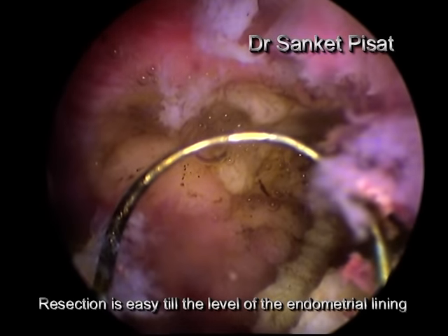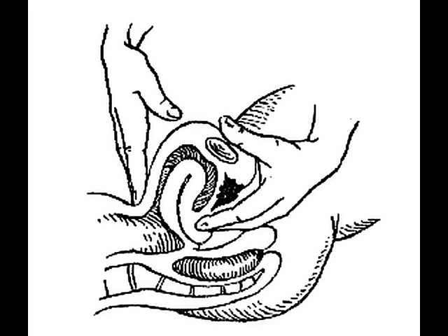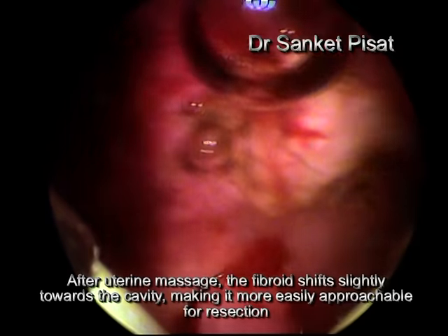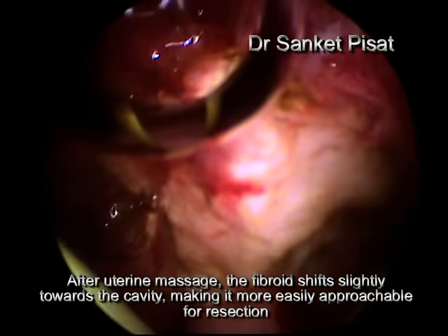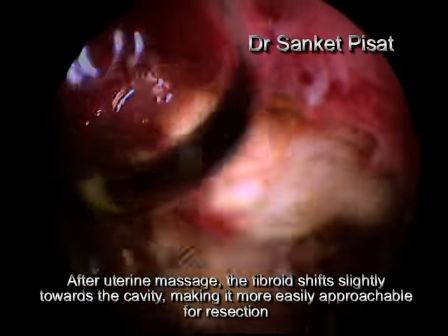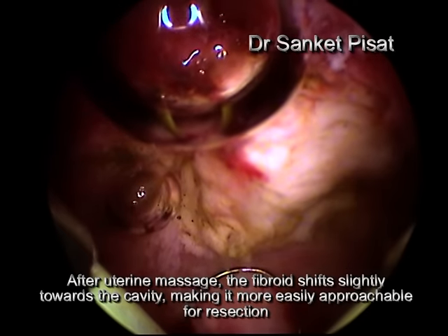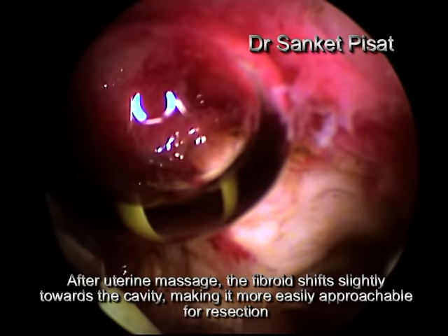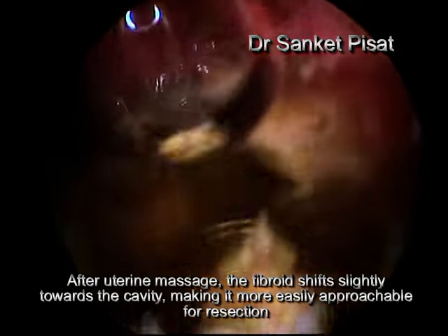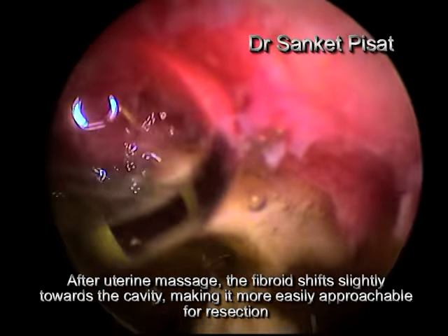It is at this stage that the hysteroscope is removed and a vigorous bimanual massage is given, causing the myometrium to contract and push the fibroid into the cavity. After uterine massage, when the hysteroscope is reinserted, the fibroid has shifted slightly towards the cavity, making it more approachable for resection. This process can be repeated.